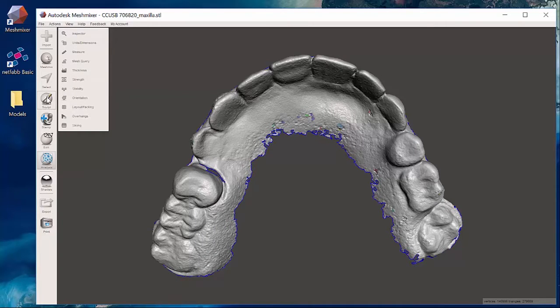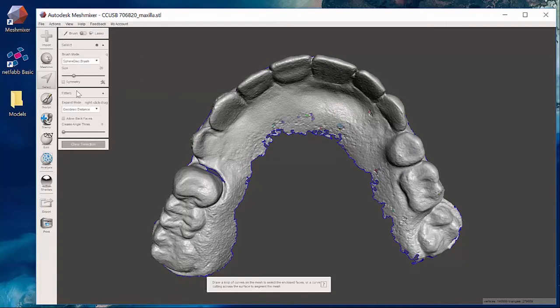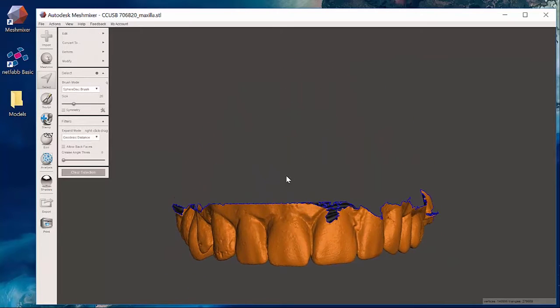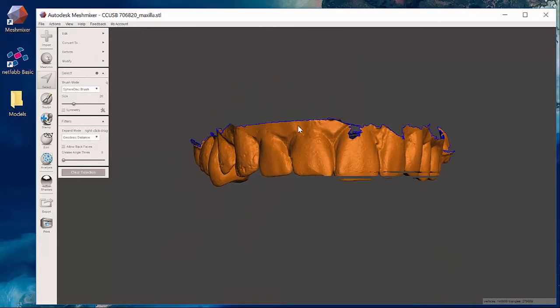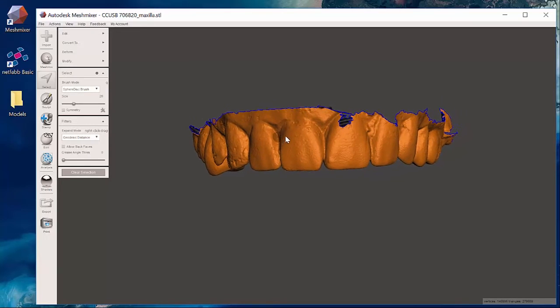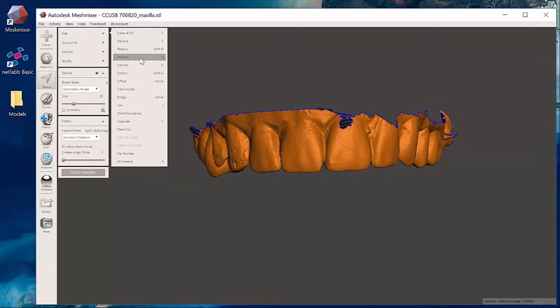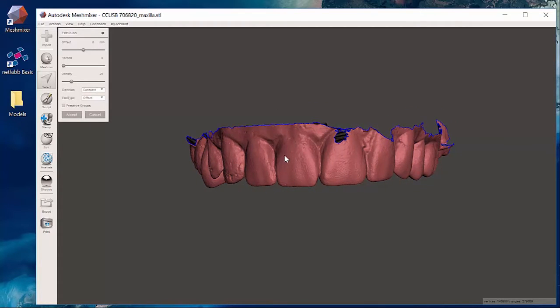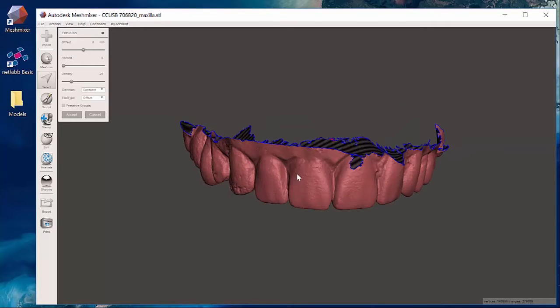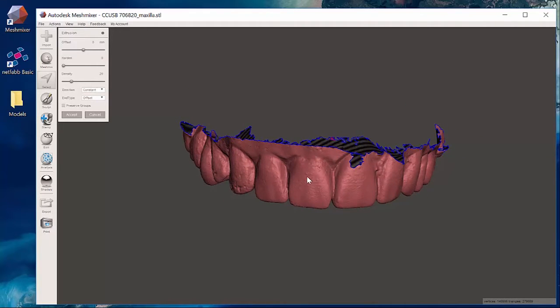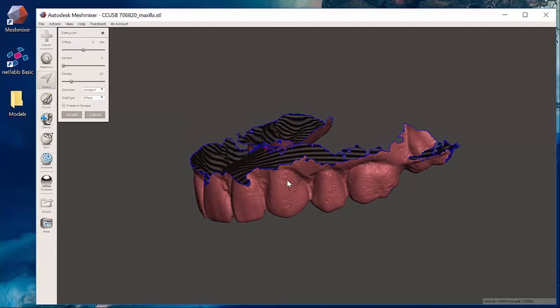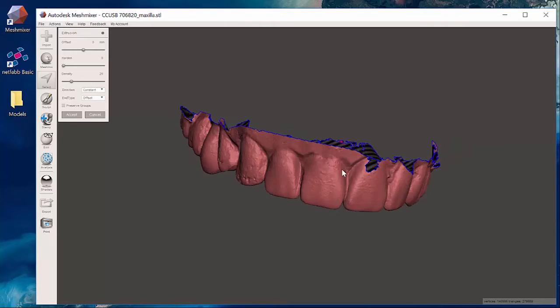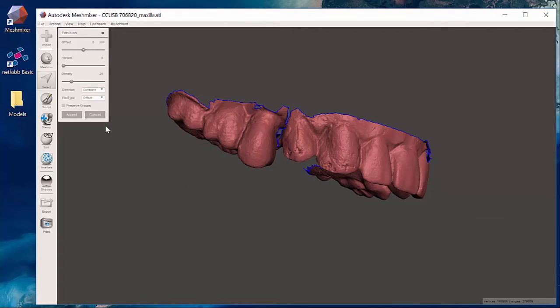I'm going to hit select and control A to select everything. Move my model into a position where I can see it. I hit the D button on the keyboard or I come up to edit extrude and it should extrude really nicely. If it looks like this kind of reddish color that means I've got something that won't let me extrude it cleanly.